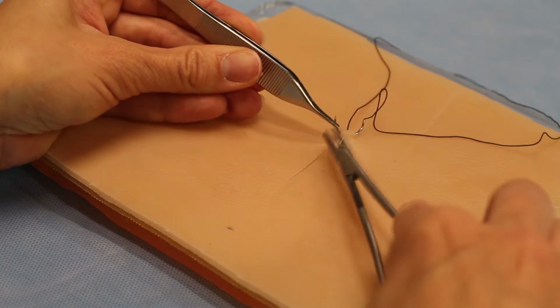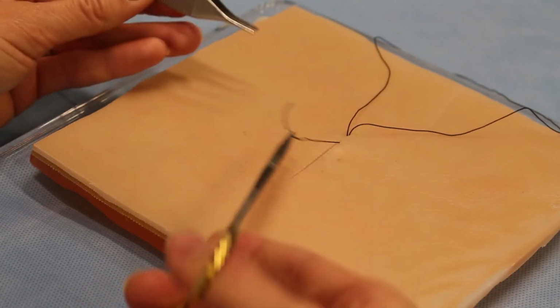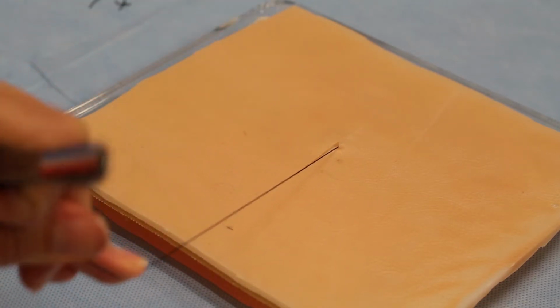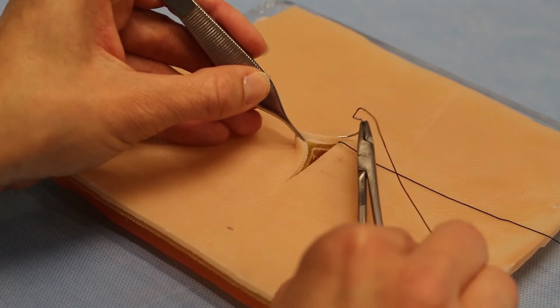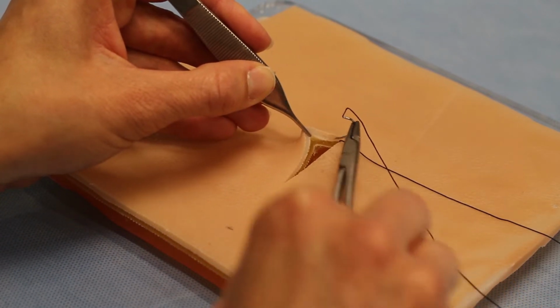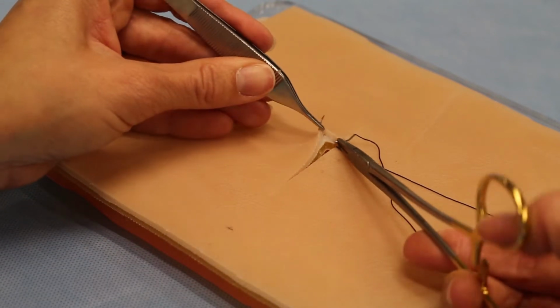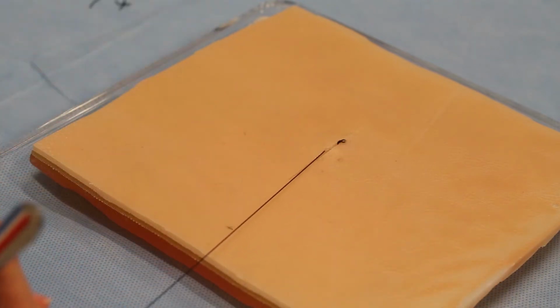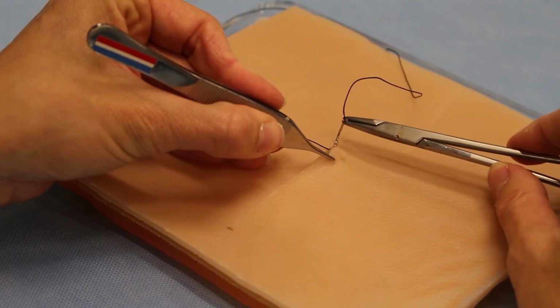You can stabilize this. This tissue's stickier than normal tissue, so it might be a little bit easier and harder in the same thing. And you're just going to continue to do the same thing. So you want to kind of go across right where you came out. You're going to go into this, rotate, come back out at just below the skin edge. Hold this up, go in at the skin edge.